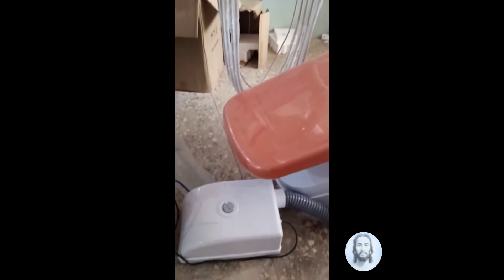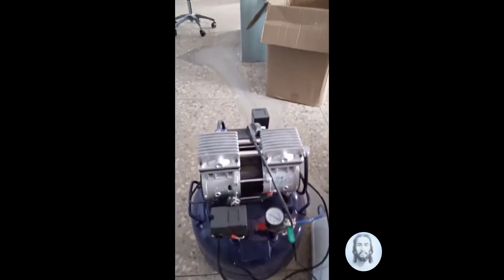Here we have the compressor — this is the compressor machine.